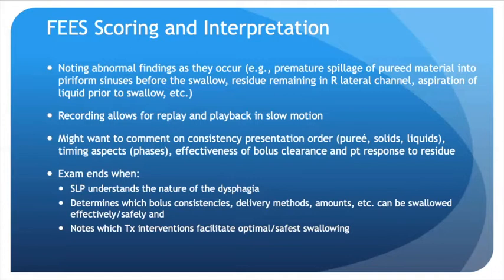You might want to comment on the consistency, presentation order, maybe various aspects of timing. So you're looking at the various phases, effectiveness of bolus clearance, and the patient's response to residue. And the exam ends when the SLP understands the nature of the dysphagia, determines which bolus consistencies, delivery methods, amounts, et cetera, can be swallowed safely and effectively, and notes which interventions facilitate optimal or safest swallowing.